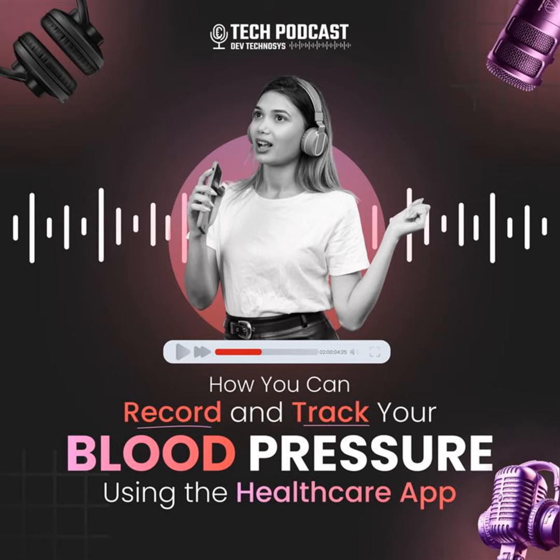Is there any extra value in apps developed specifically for clinics or hospitals? Yes. Some apps are built to sync directly with a hospital's health record system, so when you update your BP at home, your doctor can see it in real time. This is especially helpful for people under observation or managing medication adjustments.